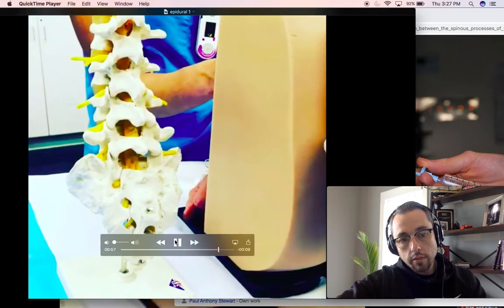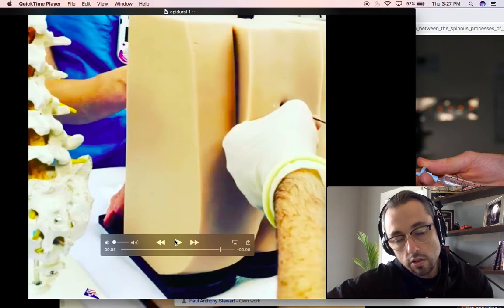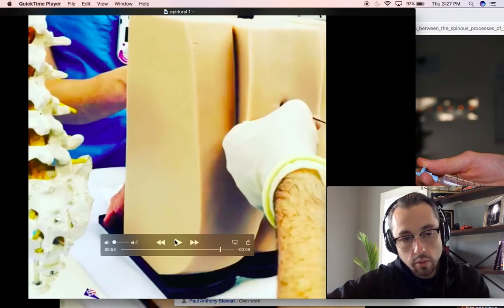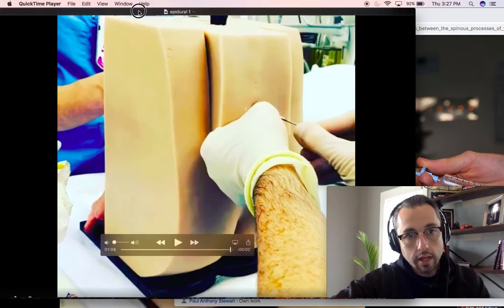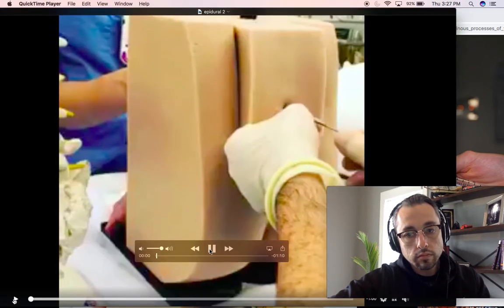And then this is your actual needle where you're going to thread your epidural through. Depending on the institution you're at, they're all sort of the same. They're much bigger needles, so for this part of the procedure, the patient should be really numb. But there are some variations in the type of needles. You want to advance at that midline point. That's exactly where I am, in the middle. We have part two here.